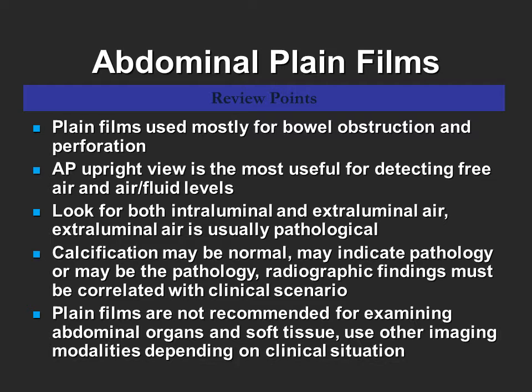There are 3 supplemental cases provided to reinforce what you have learned throughout this presentation. As you go through the cases, please click on the blue text in order to see the correct diagnosis.